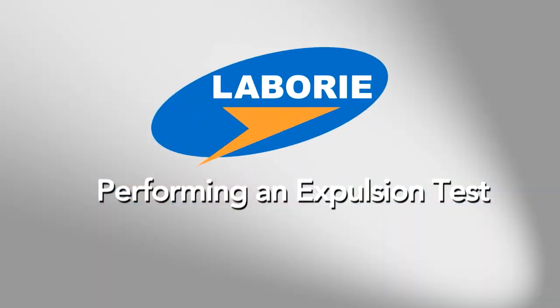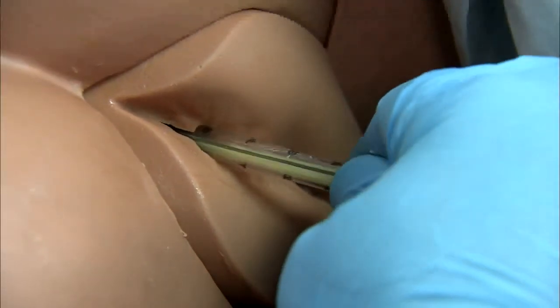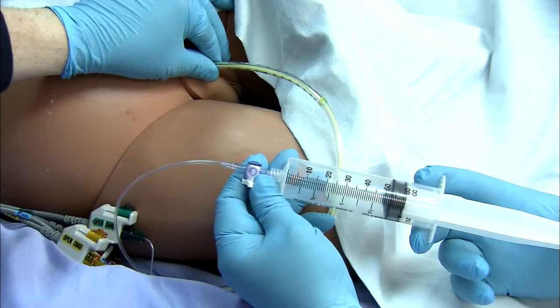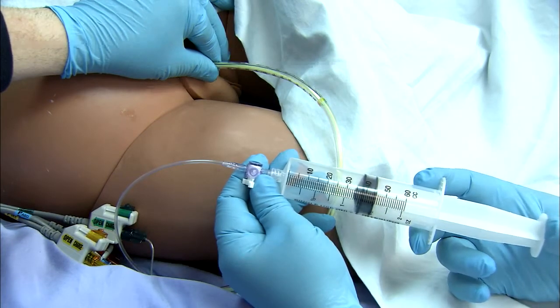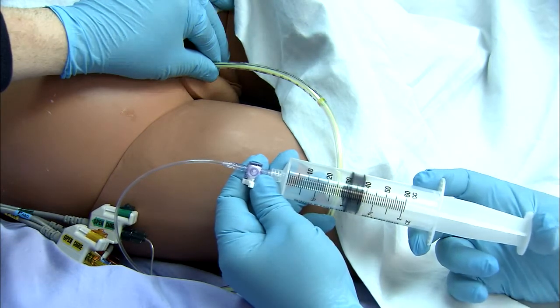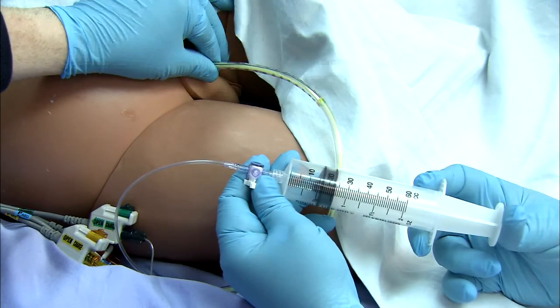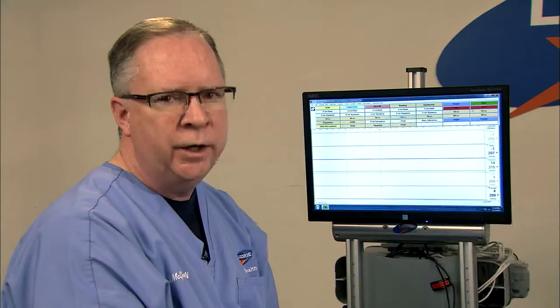One last component to this test includes the expulsion test. It requires, again, keeping the catheter at roughly the 6 centimeter location, and we're going to now insert approximately 50 cc's of air into the rectal balloon. We will simply be asking the patient to try to expel it. So whatever method they need to do it at home, however they do it at home, that's what we're going to ask them to do here.